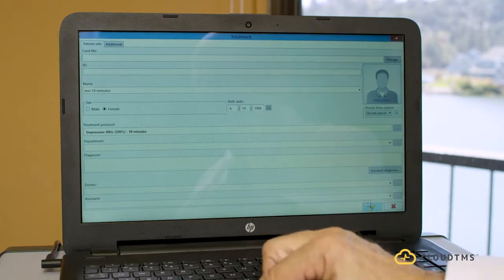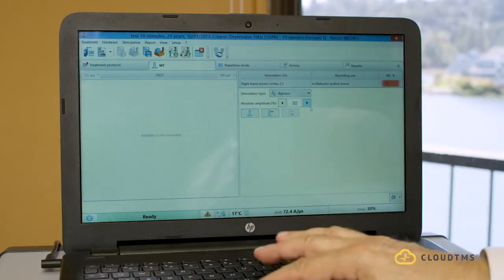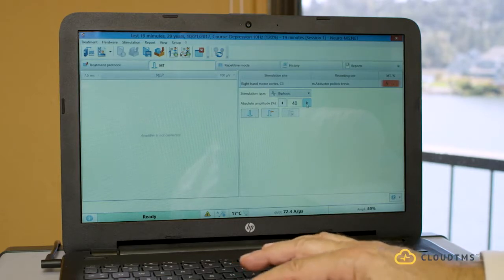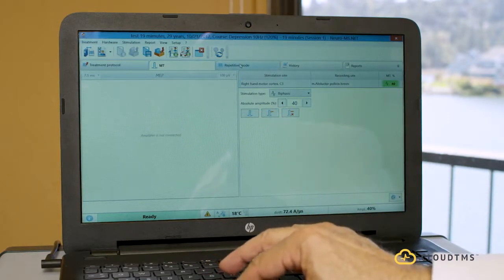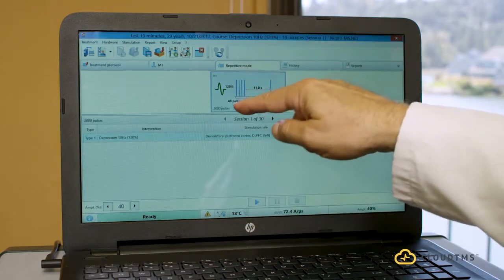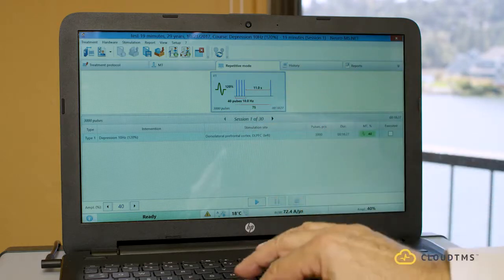Now I click that check mark here. And again, treatment protocol, you're going to adjust the motor threshold. Let's say that I can get a stimulation at 40. I fix the motor threshold, it turns green here. And now I say repetitive mode. So here's what happened. Now it's showing you 120%, 40 pulses at 10 hertz, 3,000 pulses, but the rest is 11 seconds, and that's session 1.